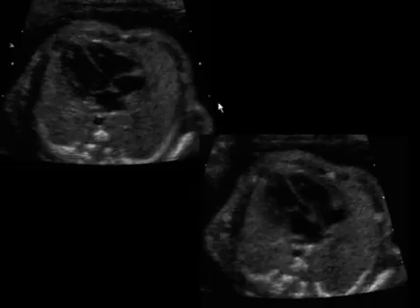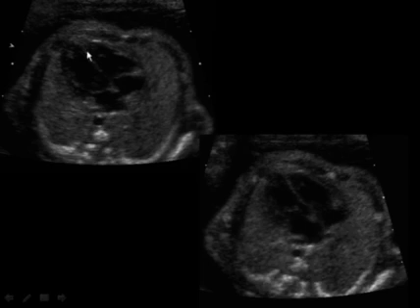So what do I mean by dropout? On this image of the four-chamber, we can see the interventricular septum here, and it gets very, very thin, and there's a suggestion that there's a big hole here between the right ventricle and the left ventricle. Could this be a VSD? Well, when we turn the image just a little bit, slide the probe a little bit more medially so that you're coming in perpendicular to the interventricular septum, you can see that the septum is intact all the way up to the root of the aorta.